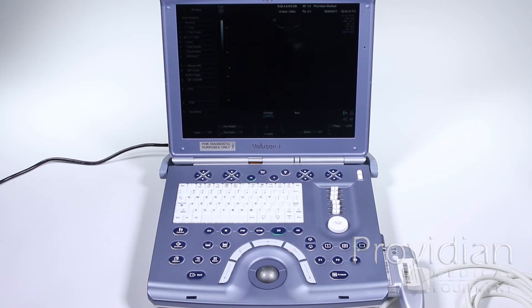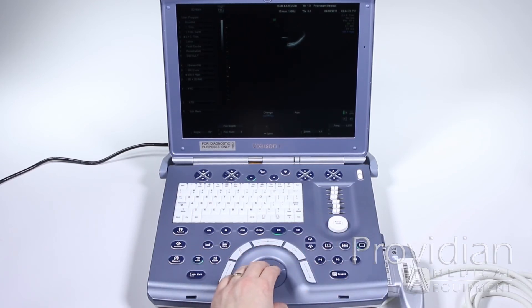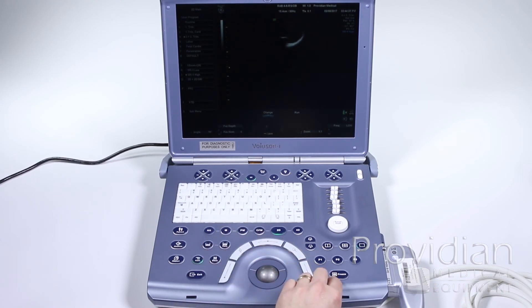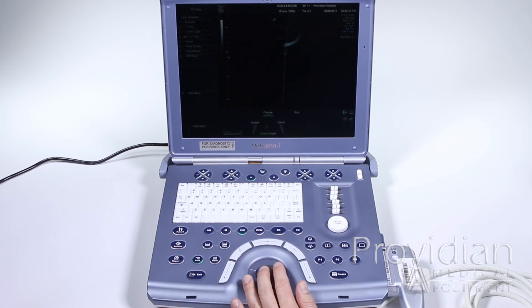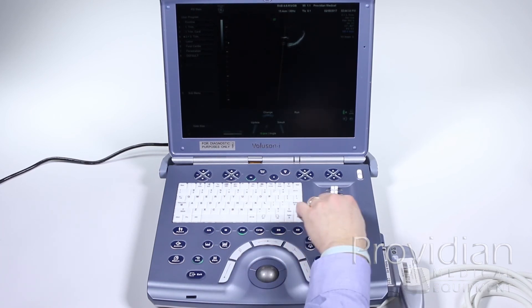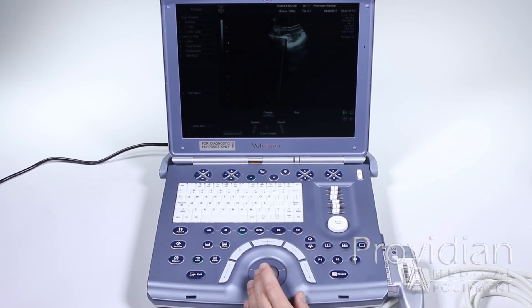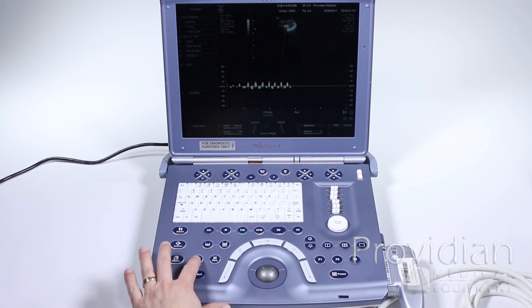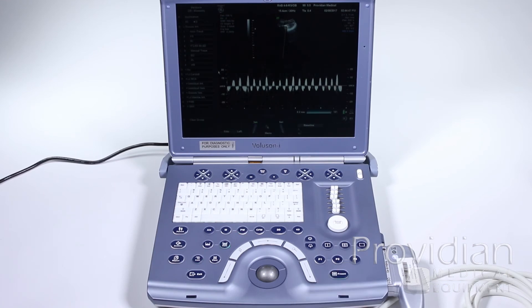Let's go back to OB and say I want to take a heart rate. I'm going to hit pulse wave Doppler as shown in the last chapter, adjust my gate, and give some gains so you can see a little better. Then I'll hit update, click auto so it automatically adjusts the scale, and then I'll freeze that image.